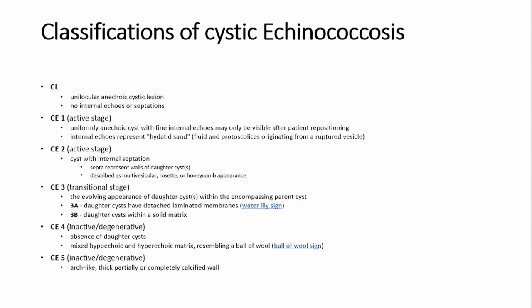CE4 is called the inactive or degenerative stage. You see absence of daughter cysts mixed with hypoechoic and hyperechoic matrix, resembling a ball of wool — called the ball-of-wool sign. Finally, CE5 is also the inactive or degenerative stage. In this category, you see thick, partially or completely calcified walls.